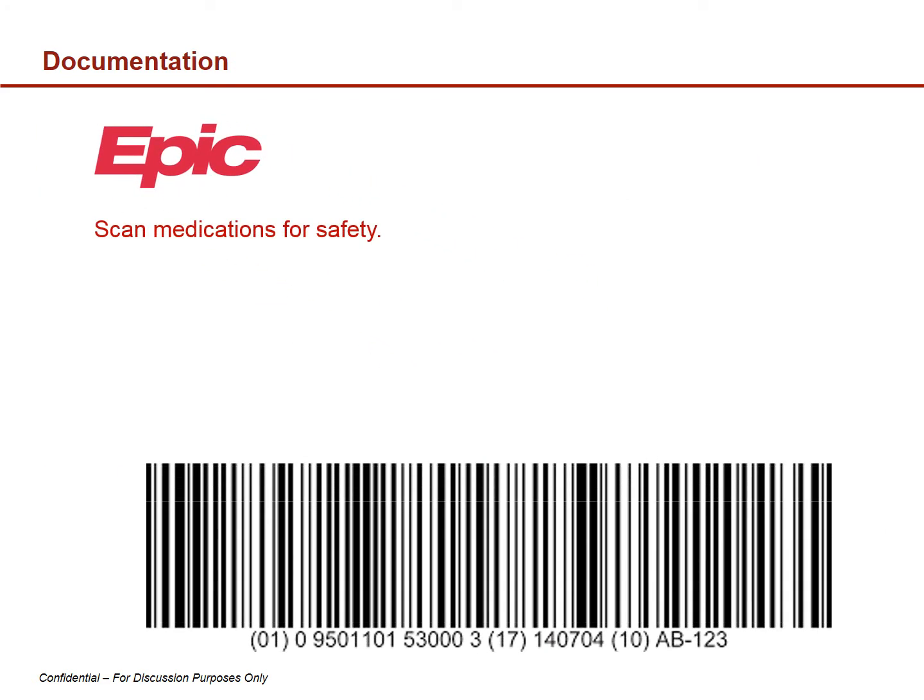Document all aerosolized medications administered in compliance with medication safety standards. Scan the barcoded inpatient or emergency patient identification band to access the electronic medical record in Epic. Scan the medication barcode to record an administration.